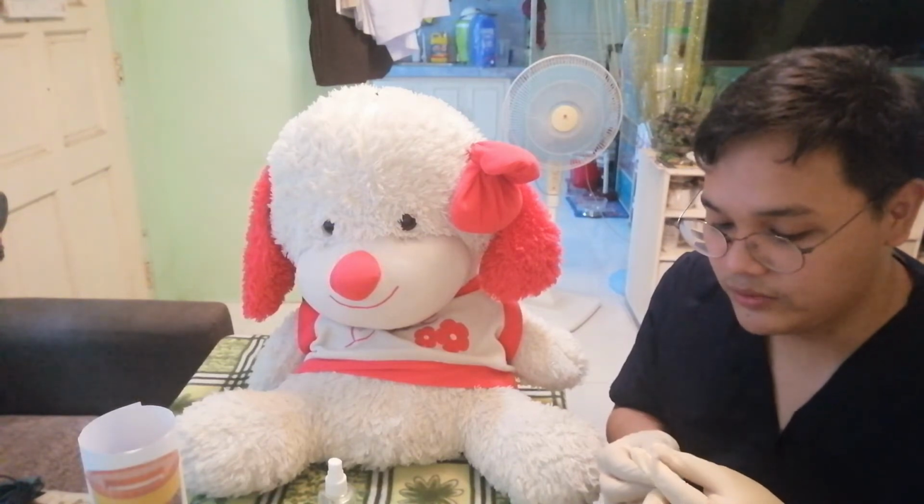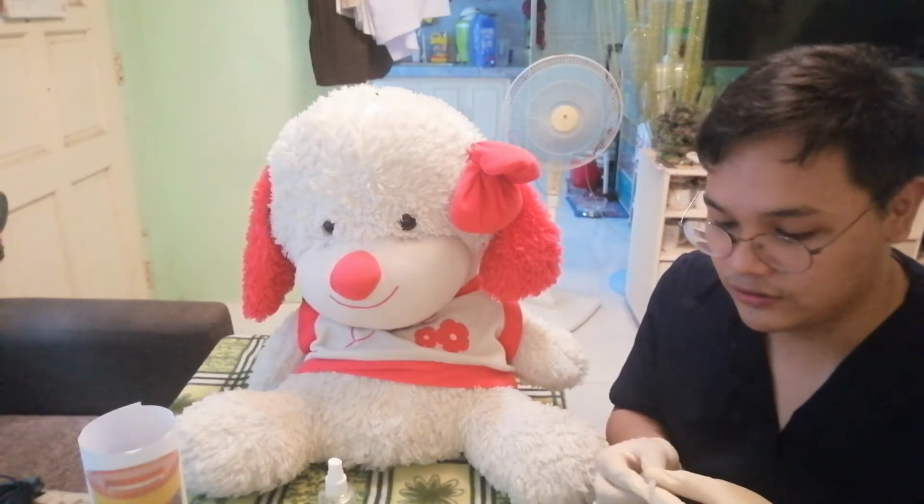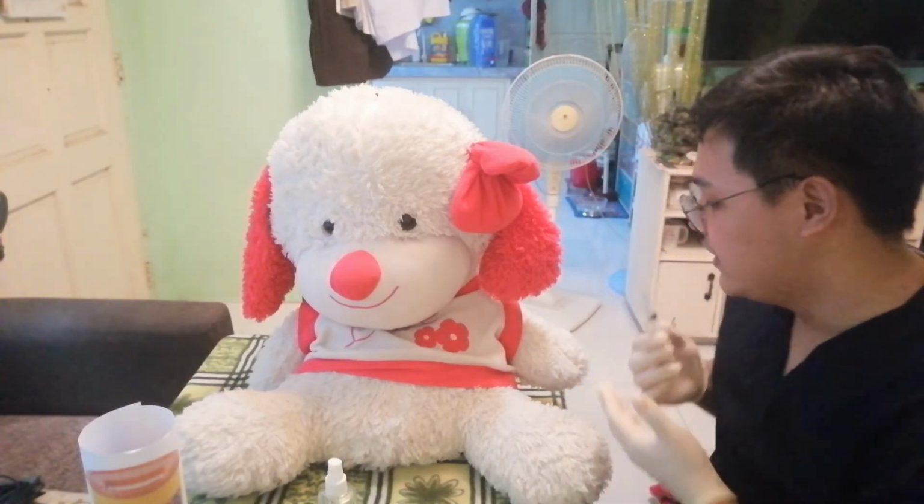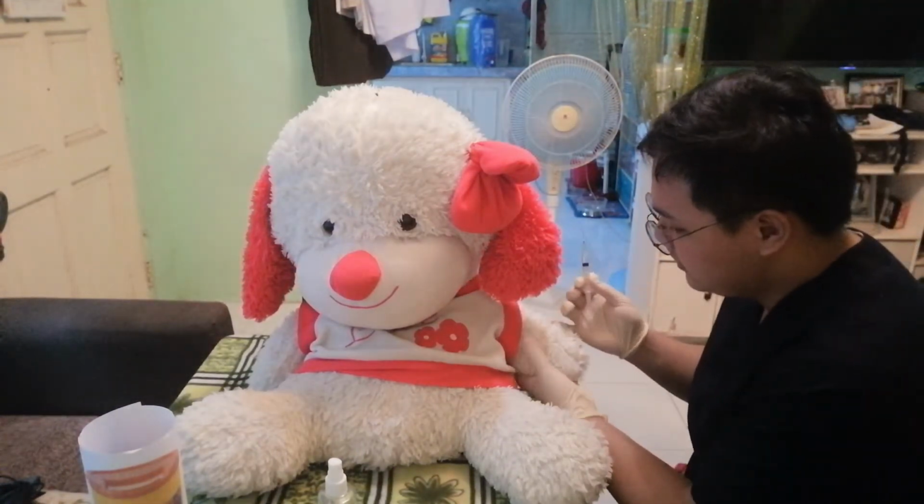And we need to remove the needle cap using our non-dominant hand. We need to pull it straight off. And after that, we will need to touch the patient's skin, or the patient's forearm, using our non-dominant hand. So we need to stretch it.